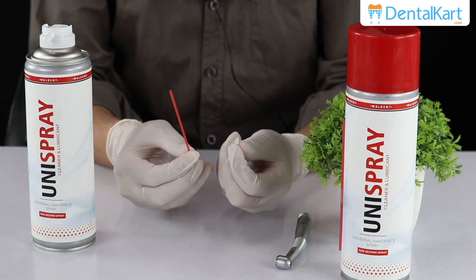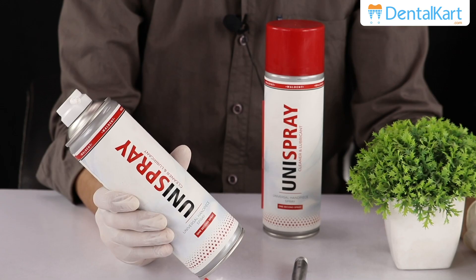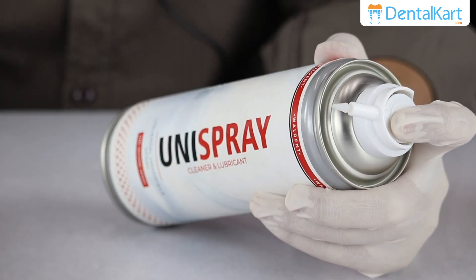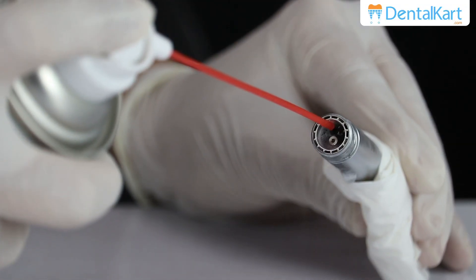Shake the spray can before application. You can attach either of the tips according to your preference. Apply the lubrication spray to the smaller hole for about a second, and to the front for chuck lubrication.